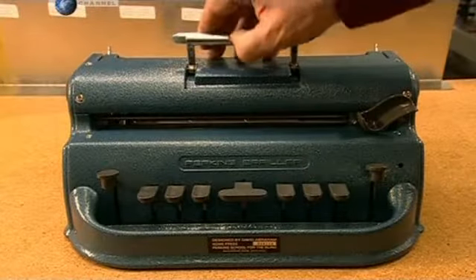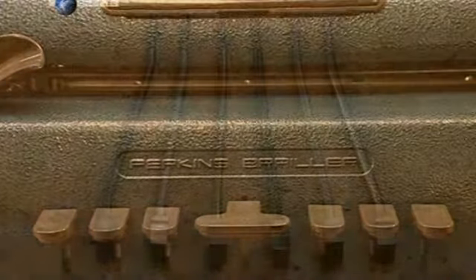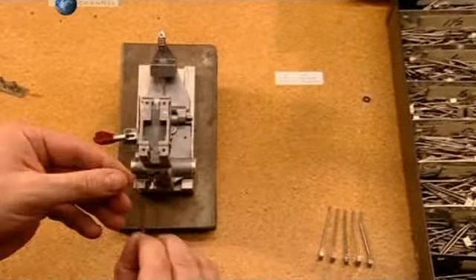A Braille typewriter has a space bar in the middle and 6 keys, 1 for each dot of the Braille cell. Pressing a key makes a pointed steel rod called a stylus type a raised dot.